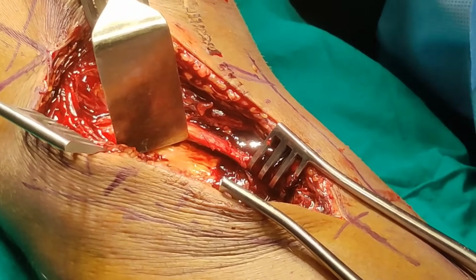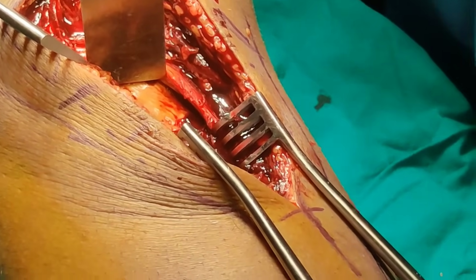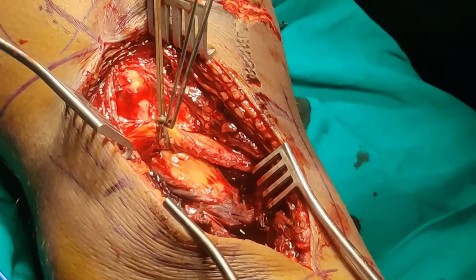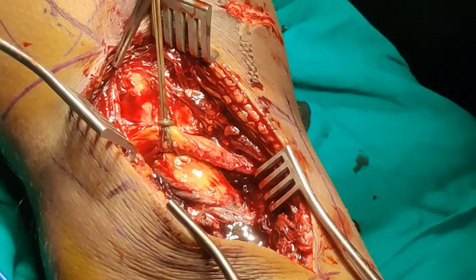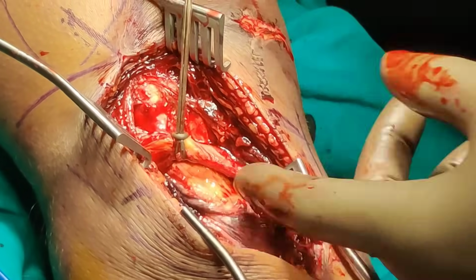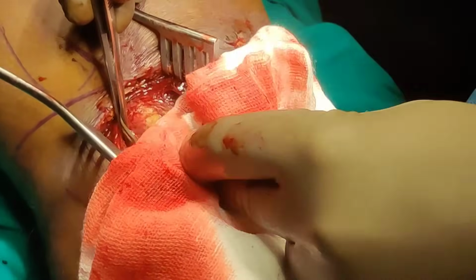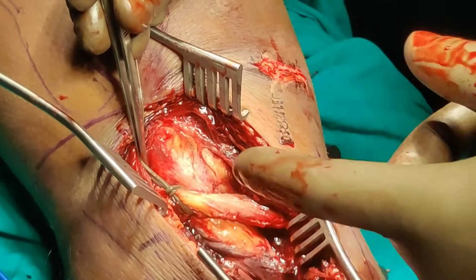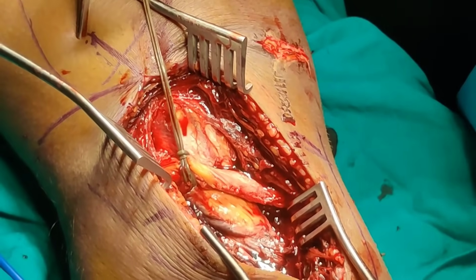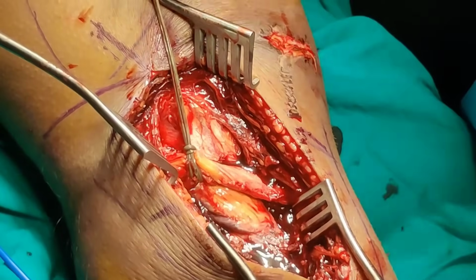So let me reposition everything, and then I will use some periosteum to identify the fracture site. So far, skin incision, fascia, crural fascia, opening of the sartorius fascia, and then you have this pes. Pes has been mobilized. Now you're right onto the bone. So you see this, can you see this structure? This is the MCL. And if you want to open the joint, if you are one of those surgeons who believe in seeing everything through the eyes, increase the incision, make a vertical incision, and then you can do an arthrotomy here, lift the meniscus, and you should be able to see the joint.